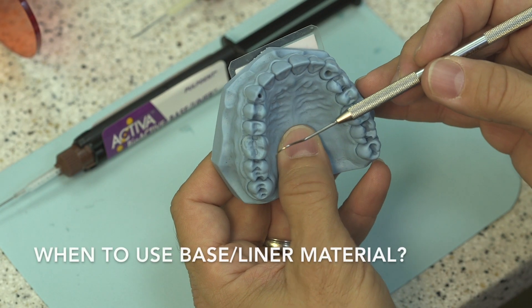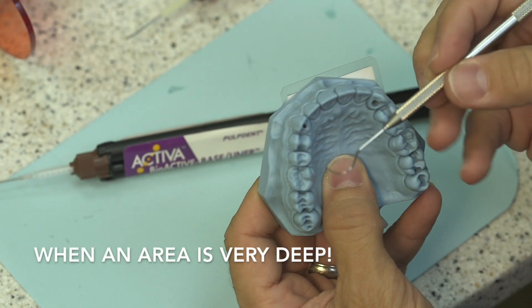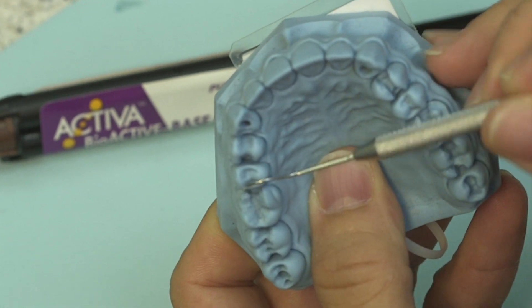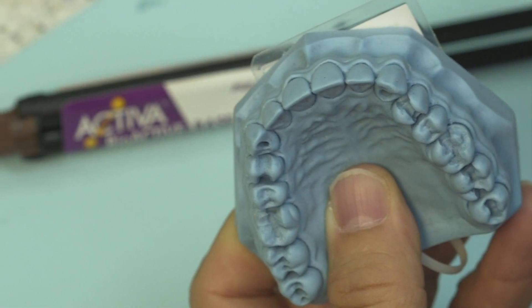A lot of folks ask, John, when do you like to use the baseliner material? And I say, anytime I've got an area that's very, very deep, such as this area here on the mesial. It's really tiny, but it's deeper into the dentin, and I want to protect that area there.